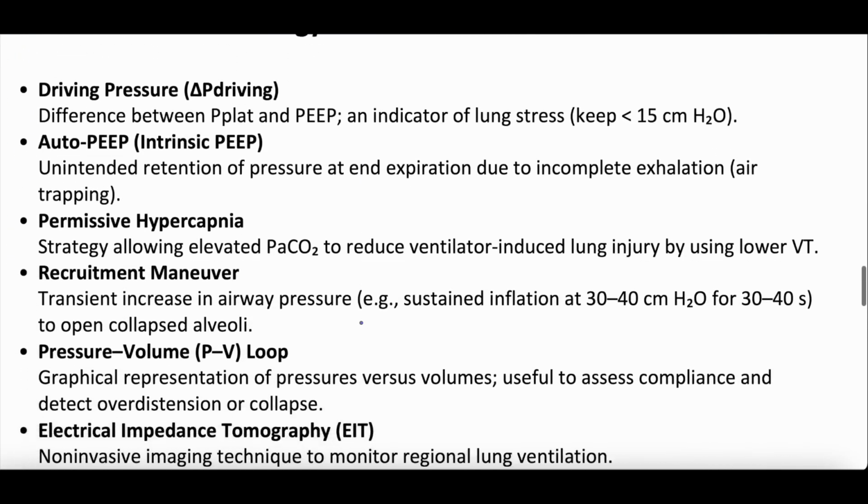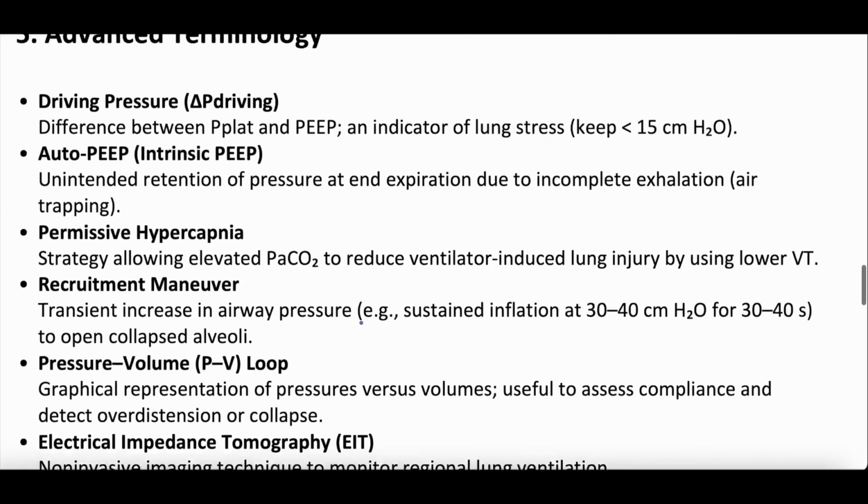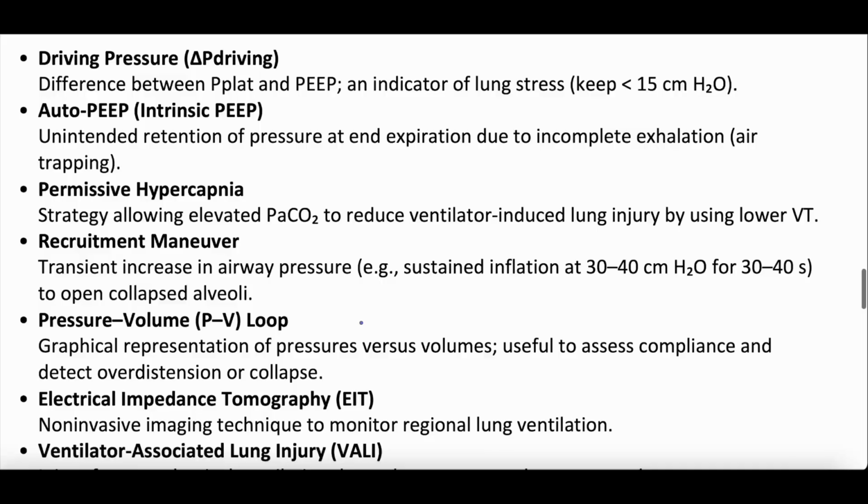Advanced terminology. I think we're getting close to the end. There's advanced terminology, then troubleshooting. Advanced terminology starts with driving pressure. We have a whole episode on driving pressure as well. This is the plateau pressure minus the PEEP, okay? And it can be an indicator of lung alveoli distension. The goal is to keep it less than 15.